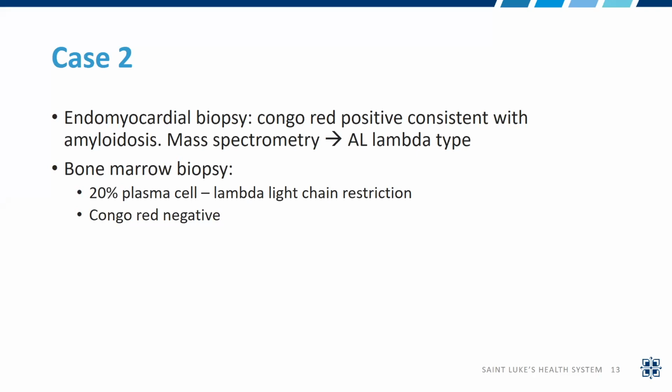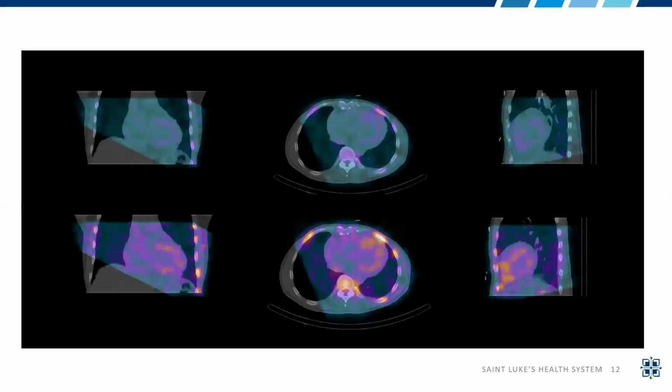So to have just a mildly abnormal lambda level, but then with 20% bone marrow involvement and with the myocardium being involved there, that really is a sobering case to me, and makes the point that you have to take lambda seriously regardless of what the PYP shows, number one, and number two, you can have these PYPs that are kind of borderline or grade 1 when you're grading on the SPECT, and those are the cases where you can see this quote false positive PYP in patients who have AL.